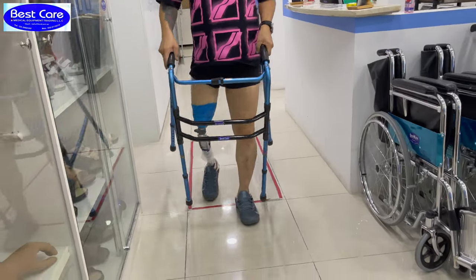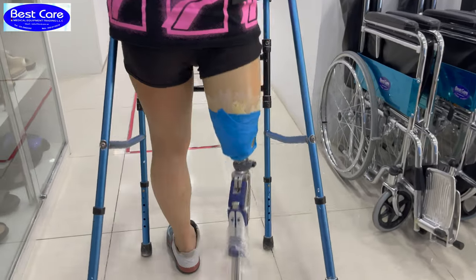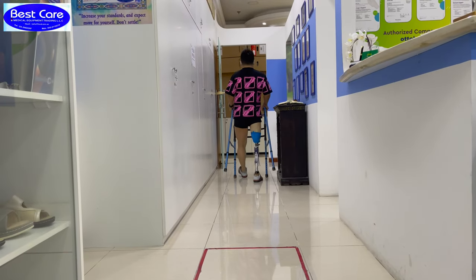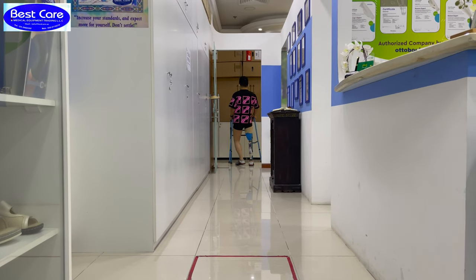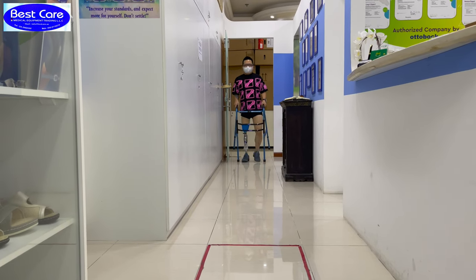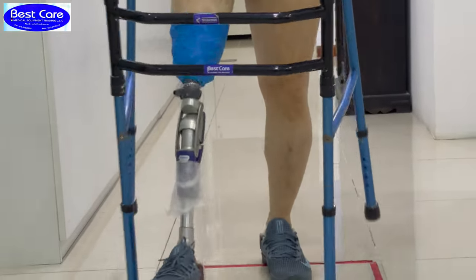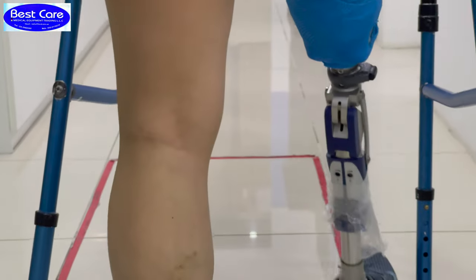This is very important that you consider all the points of alignment. You can see it's very important. And especially when you are using it for a person who is wearing the silicone liner, the knee height is very important and you have to measure it exactly to know what the middle of the knee is to be considered exactly. And this is why he is now walking with the walking frame, because it's the first day of the trial.